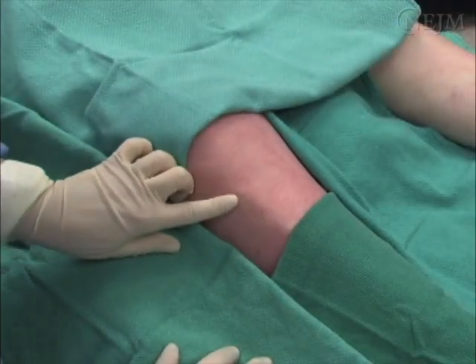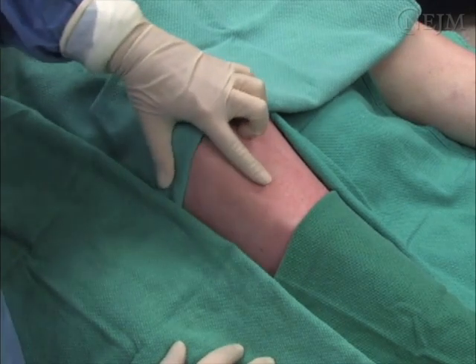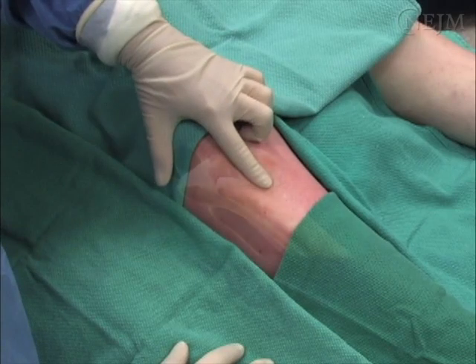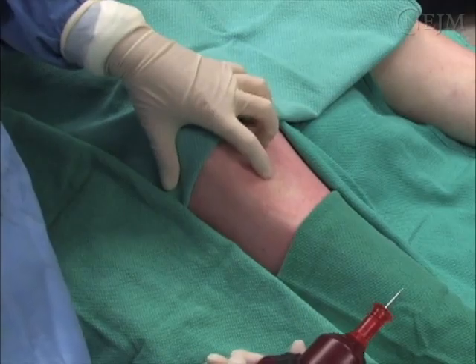tuberosity. The desired insertion site is the flat medial surface of the tibia medially 1 finger's width away from the tibial tuberosity. Stabilize the leg with the non-dominant hand.